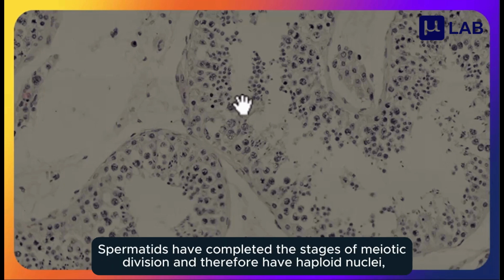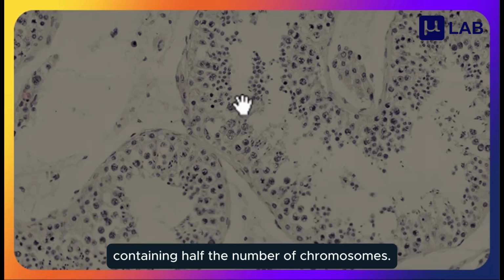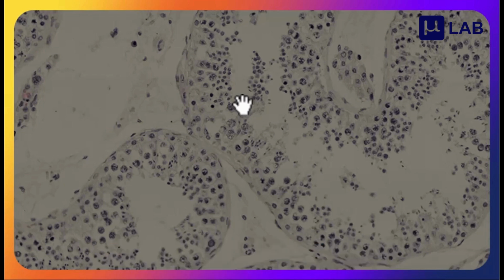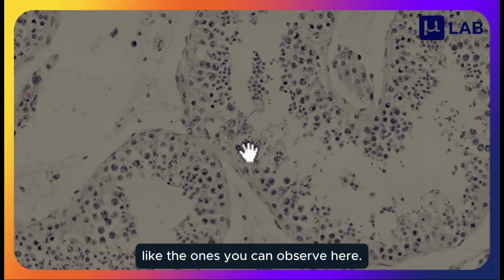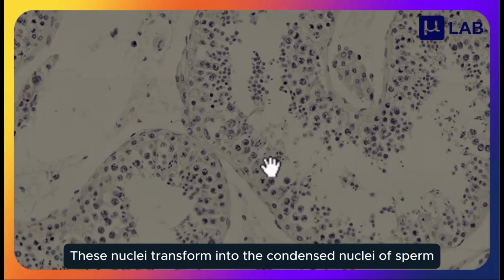Spermatids have completed the stages of meiotic division and therefore have haploid nuclei containing half the number of chromosomes. After that, they undergo differentiation. Their nuclei become more condensed and elongated, like the ones you can observe here. These nuclei transform into the condensed nuclei of sperm.